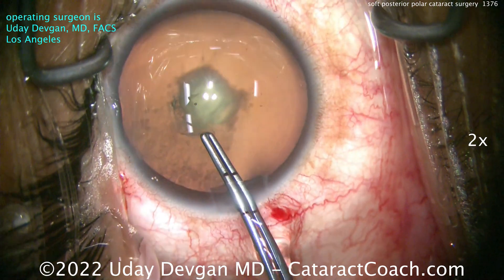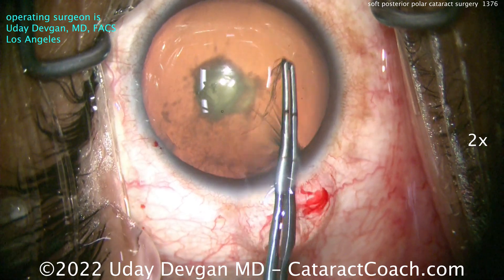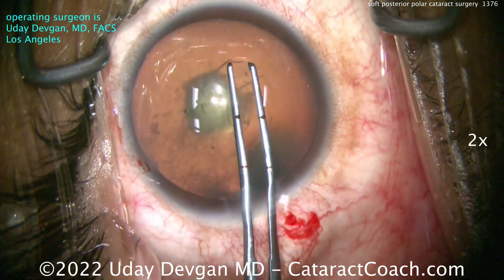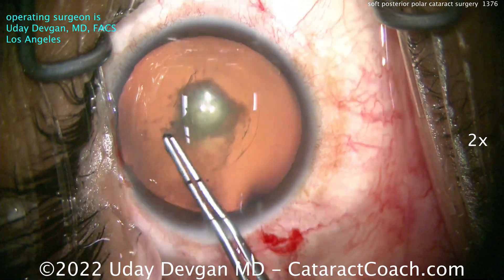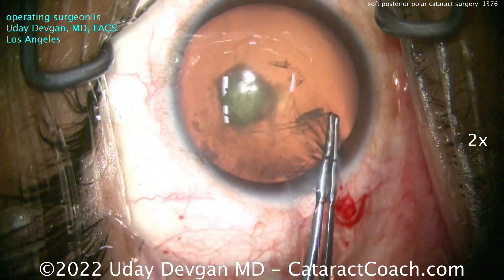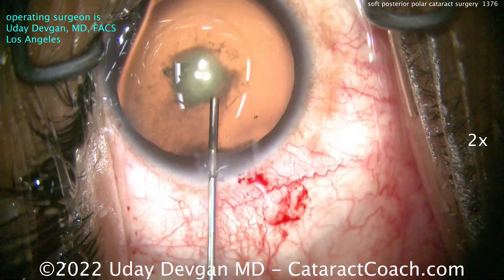You can see it's a very soft lens. The patient is about 40 years old and still has a little bit of accommodation left. We're making our rhexis here, and I'm very careful not to make an overly large rhexis. He's very widely dilated, a little bit myopic, and has a larger white-to-white measurement. So I keep measuring to achieve that five millimeter rhexis. Do not make an oversized rhexis.